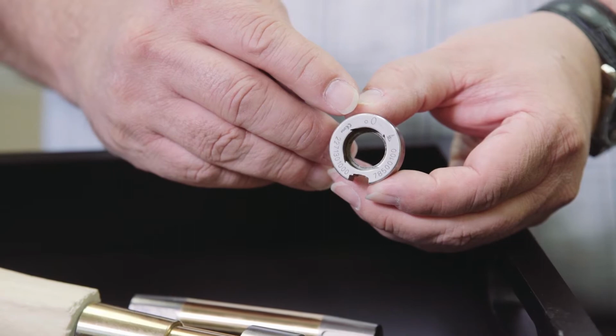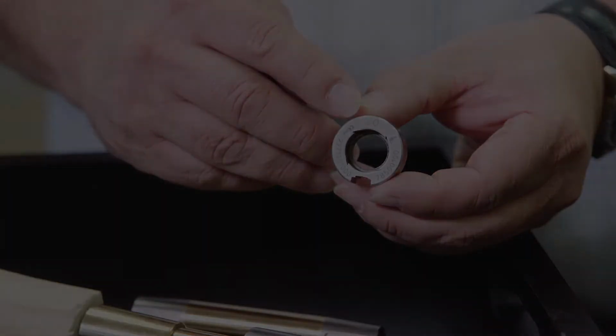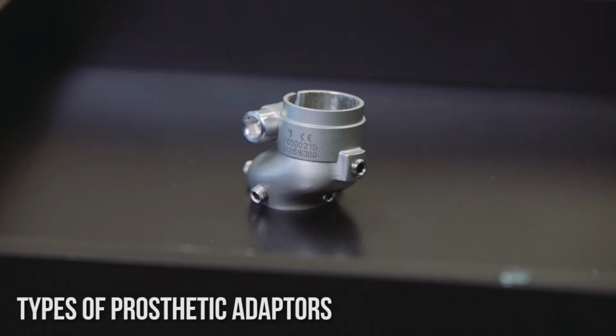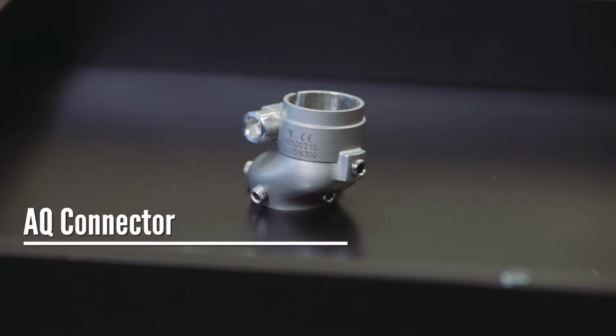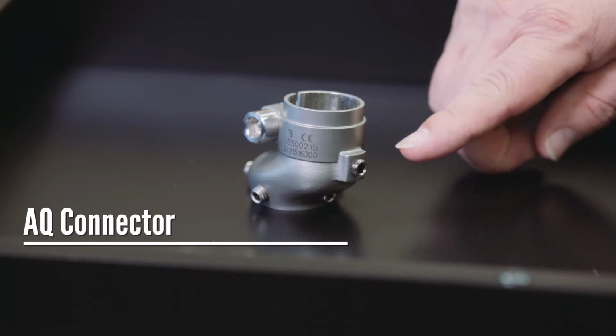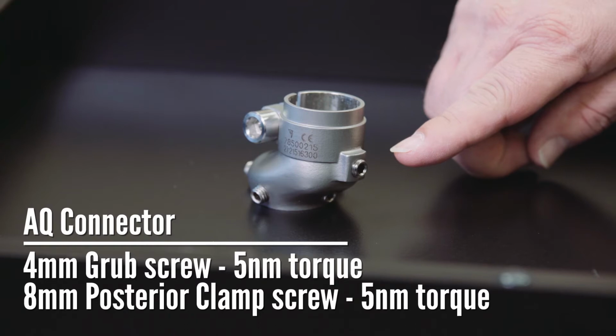Attached to the taper sleeve and bushing are the prosthetic connectors. There are two main varieties of these. Each, though, has similar function. The first type is often termed an AQ connector. It has a locking or grub screw that must be tightened to secure the prosthesis to the taper sleeve and implant. The torque setting for this screw is 5 Nm.